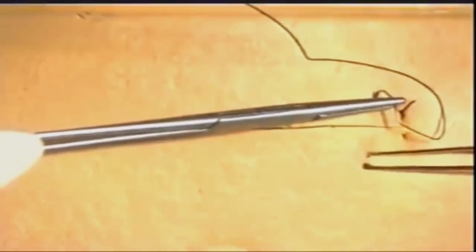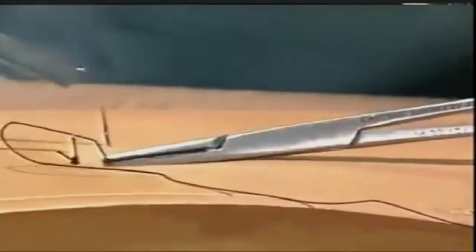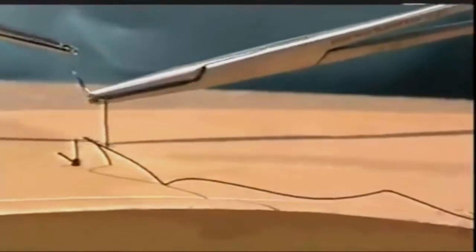A second vertical mattress suture is inserted. The suture is placed, the needle then reversed in the needle holder, and then going back taking just a few millimetres of skin edges. The knot is then tied and the suture material cut.